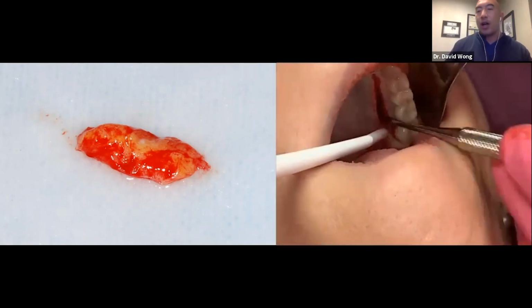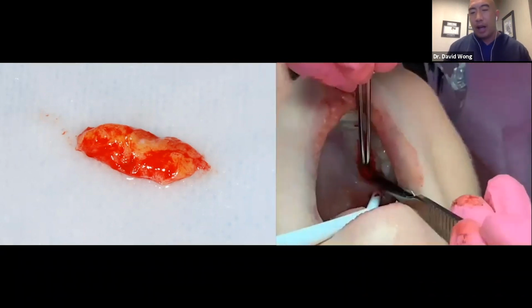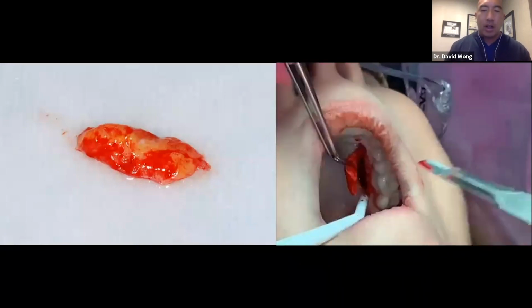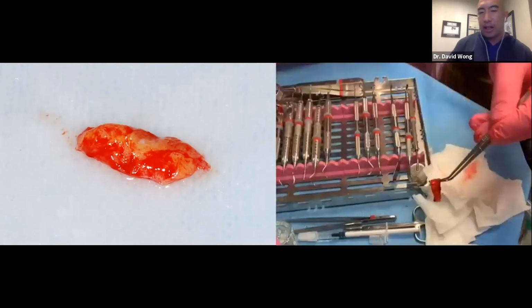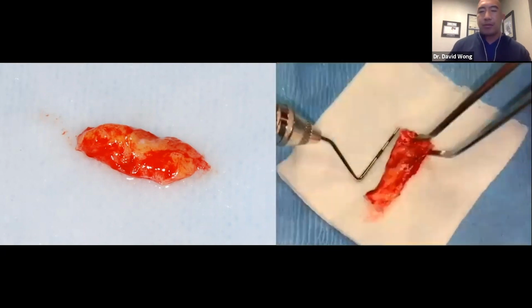Connective tissue grafts also have a better color match overall. And generally they have a high success rate because we're not around implants, especially because it's covered with the patient's tissue versus just left hanging like a free gingival graft. So that's how we harvest our connective tissue graft.